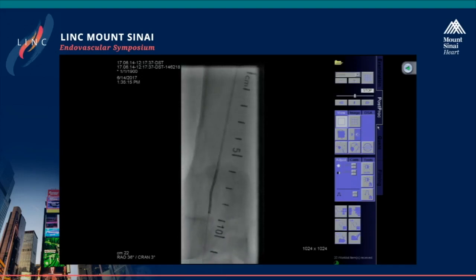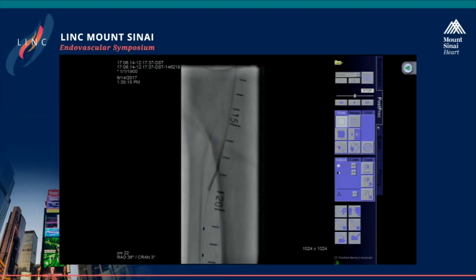So what we're going to try to do now is just meet the two down below at the level, make life a little bit easier. And see whether we can just, there we go. There you go. All right, now push, push. All right, great. All right, wonderful. Look, now just push the wire out, Michelle. It should go no problem. Wire's all the way up?